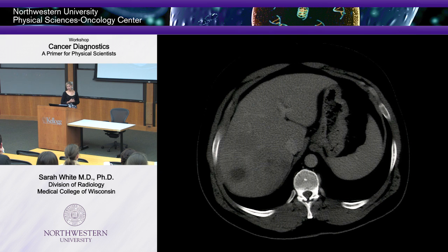So they get a CT scan. Does anybody see anything wrong? So we're looking now at an axial image, so I've cut you like this. Okay, we're at the level of the liver. So this is the back, this is the backbone. These are your ribs. This very thin line is your skin. This is your liver. This is your stomach. This is your spleen.